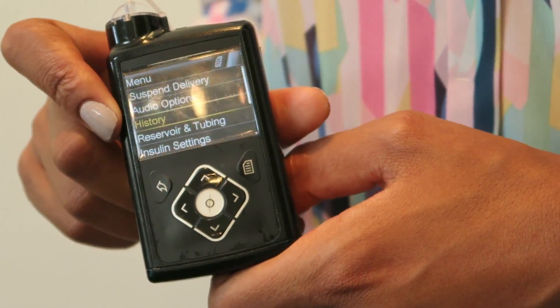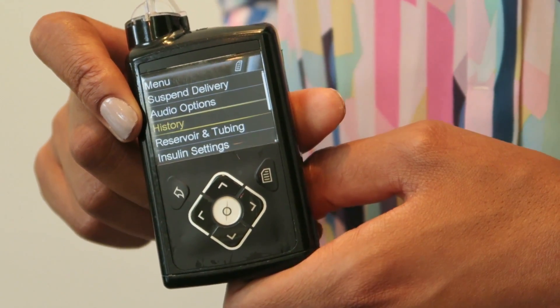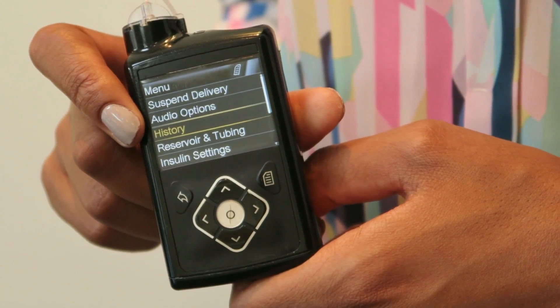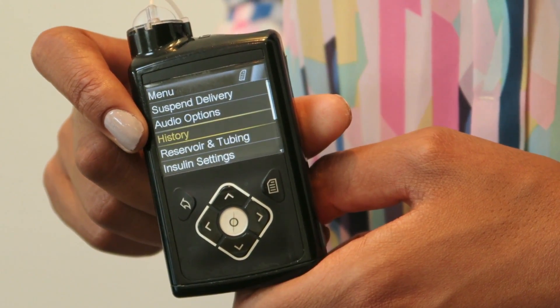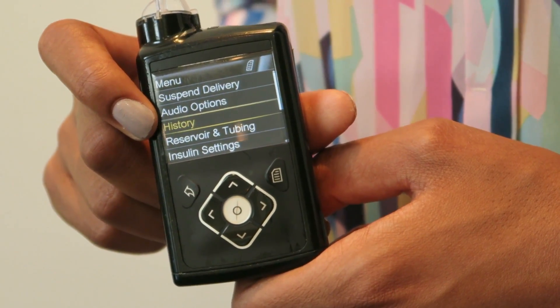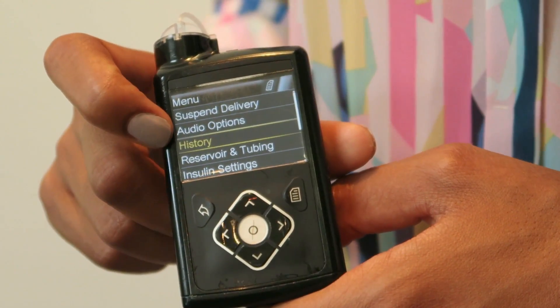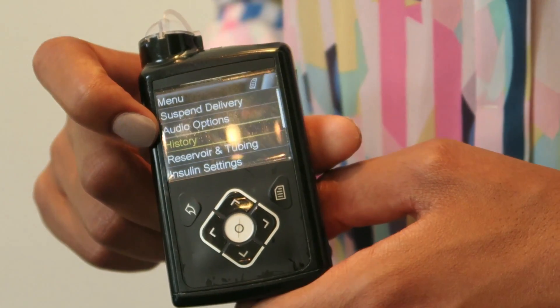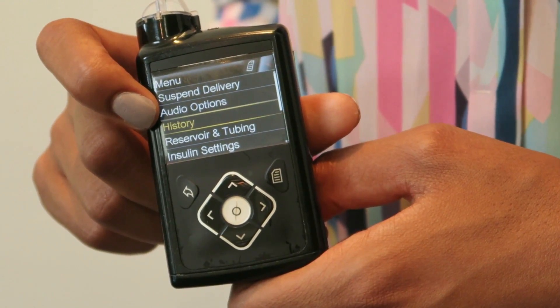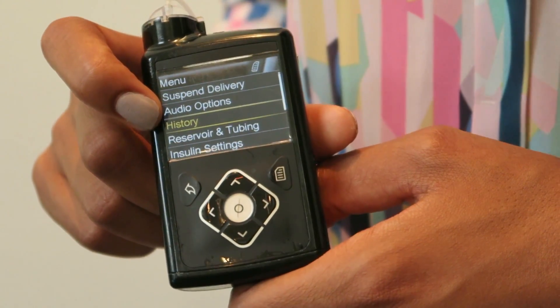The history option is something that's really handy about insulin pumps compared to injections, because if for example you think you've forgotten to take your insulin, with an insulin pump you can just check back and see whether you've taken it or not. This gives an account of the last day or couple of days to see what's been going on, so you can look at your total daily doses as well.